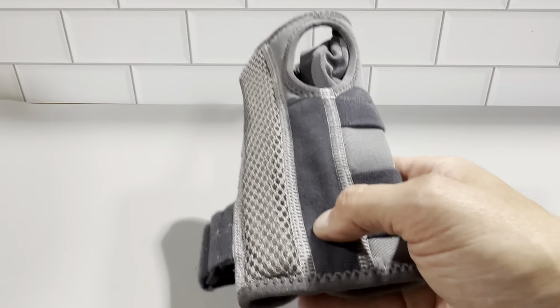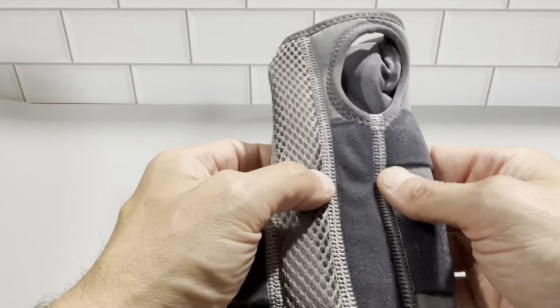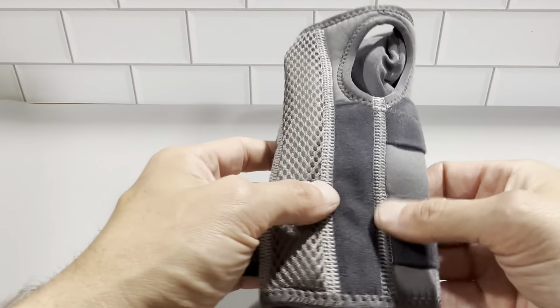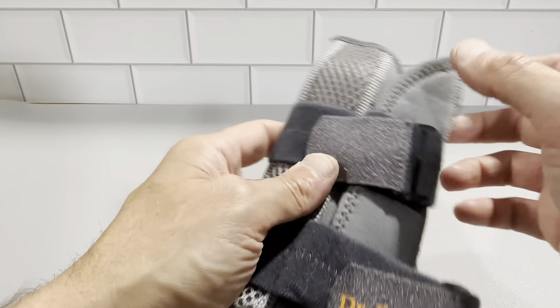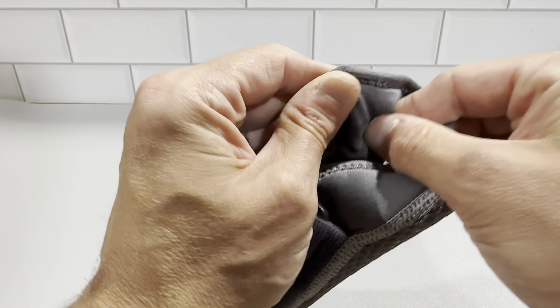This is made out of 38% nylon, 10% polyester, 28% foam, 10% microbead, and 14% plastic. This is the microbead right in here — you can see and hear it moving around in there.